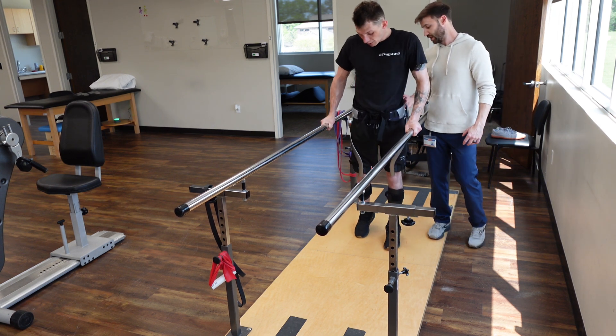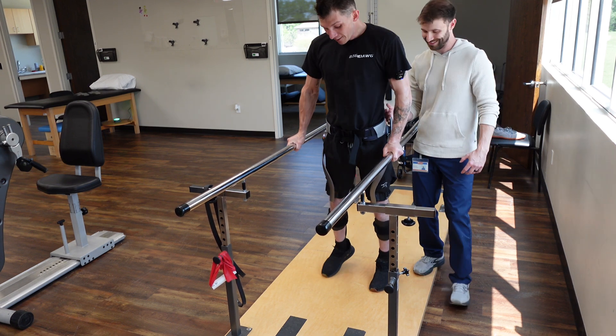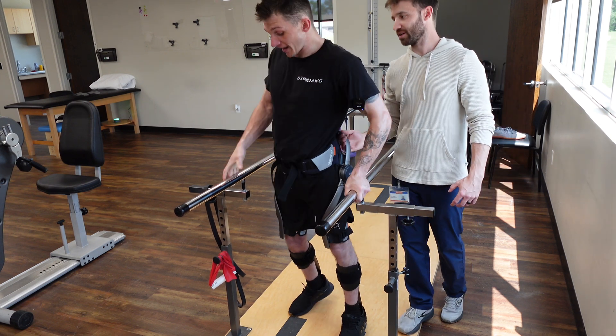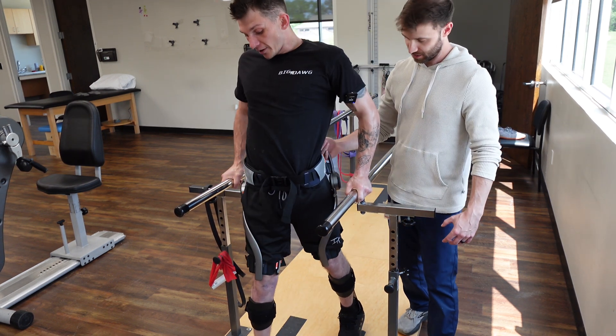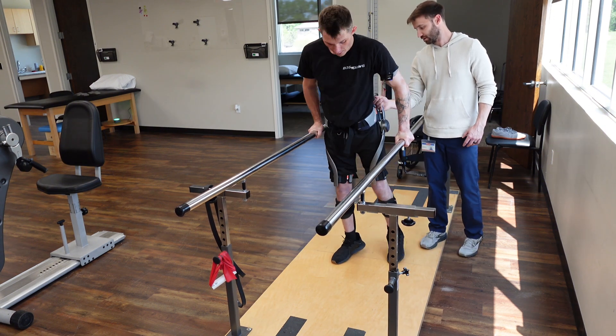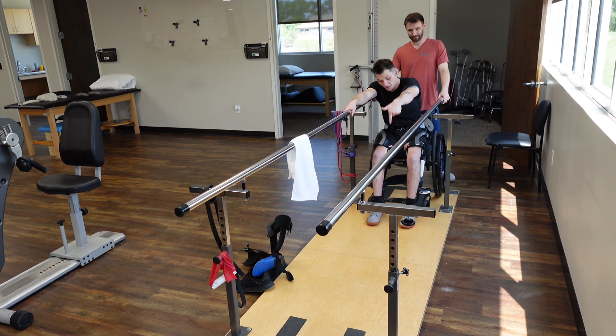That was a nice one. Either your right quad's awake or it's... we're figuring it out, it's just doing more. This is overall better — we are getting somewhere. Normally my glute will overpower and kind of pull that left leg backwards. No braces, just my robo legs. Let's see what happens.